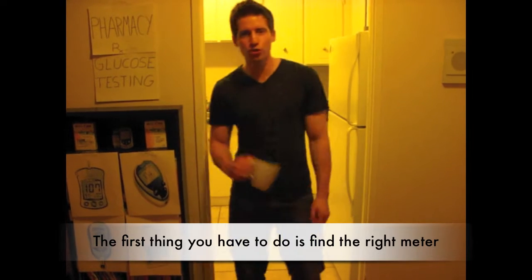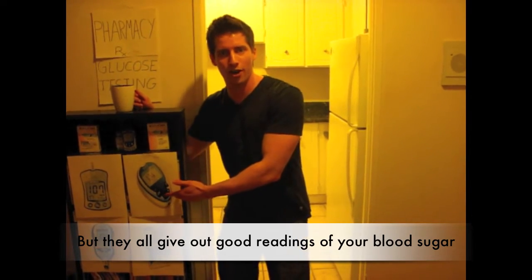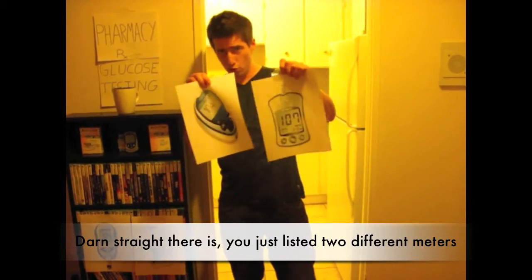The first thing you have to do is find the right meter. There are many types of meters that are popular, but they all give good readings of your blood sugar. I'm a busy man and I can't handle pain. Darn straight there is, you just listed two different meters.